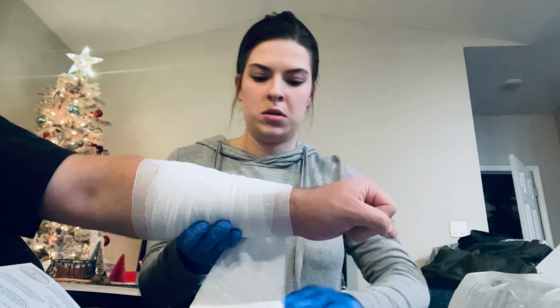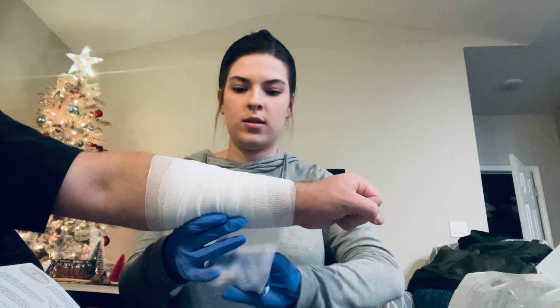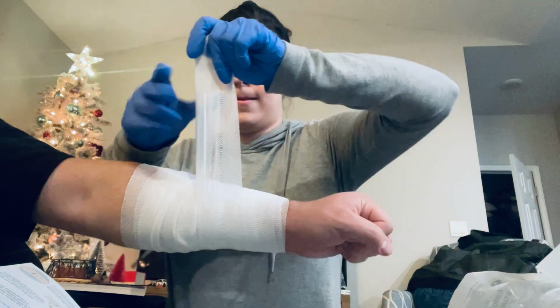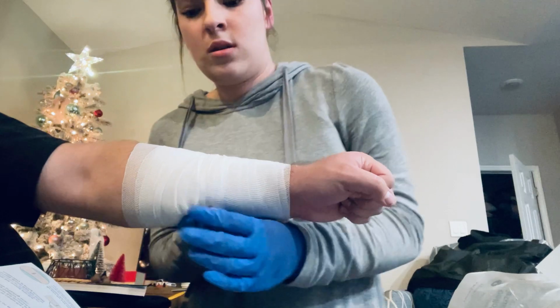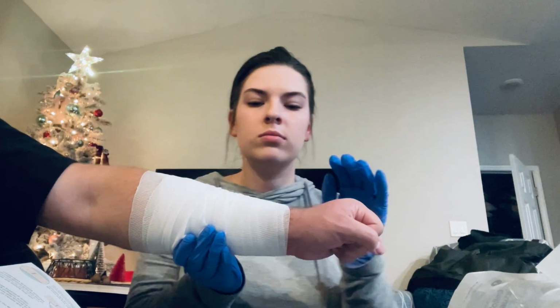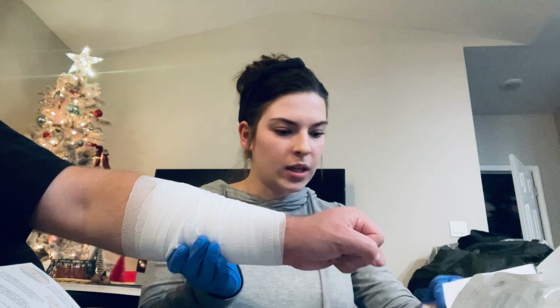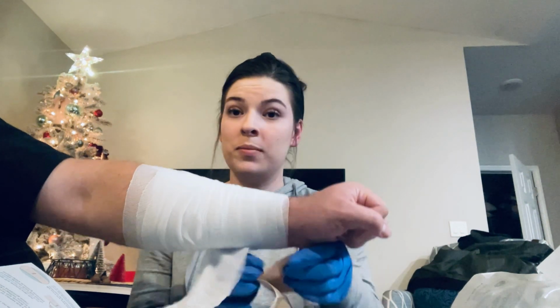And for the sake of this video, we're just going to use up all of this. So in these instances, you can tie off your bandage if you have it, but I have some adhesive tape, and take the tape. So sorry, one second.